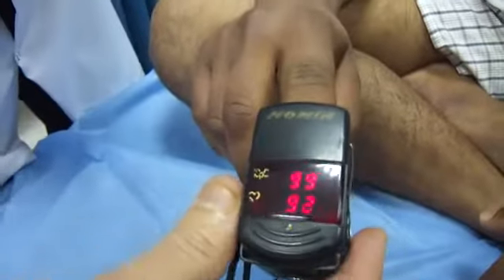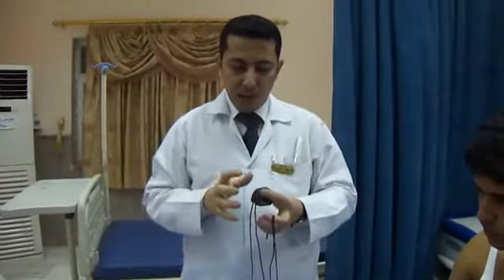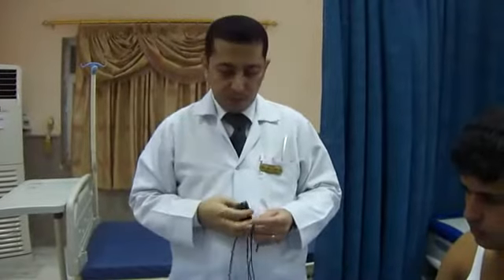And we have to know that the pulse oximetry can detect hypoxia before the patient becomes cyanosed. And we have many situations in which the pulse oximeter is not accurate. For example, if the patient had hypothermia, or severe vasoconstriction, or the patient has cardiogenic shock or hypovolemic shock, this will not function.